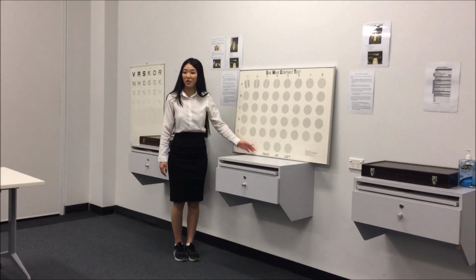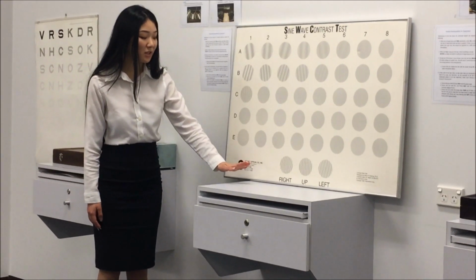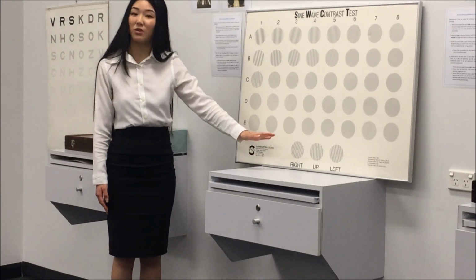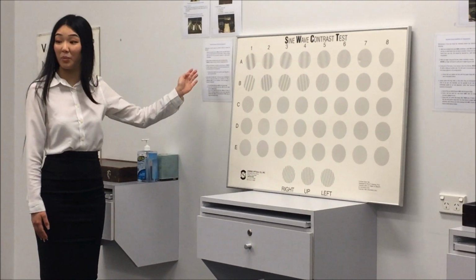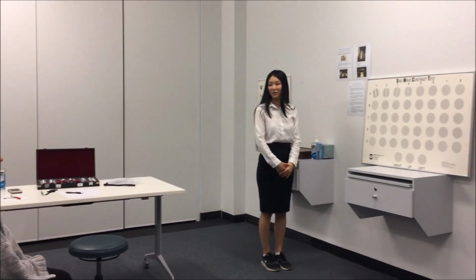So these are the demonstration patches at the bottom. There's 3 of them. One of them, the gradings is going to the right, one of the gradings is going straight up, and the last one, the grading is pointing to the left. Do you have any questions? No. Okay, so we'll just start by reading this like a book, starting on row A, and then you just tell me which way you think the gradings are facing.